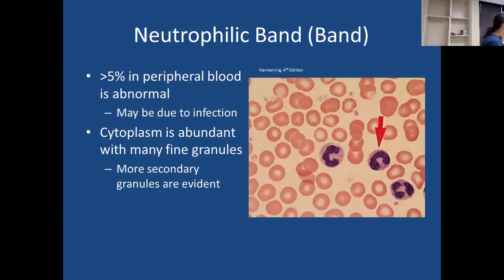All right, so remember I said that controversy. So here is a perfect example of what a banded neutrophil looks like. Notice the difference between this and a segmented neutrophil. We call this one a segmented neutrophil because of this visible filament right here. A segmented neutrophil is termed segmented because the nucleus is broken into segments by visible filaments. Notice this one has no filaments, it's a solid nucleus. So this is a segmented neutrophil. You can see the filament. A banded neutrophil. And again, it's normal to see banded neutrophils in peripheral circulation up to 5%.